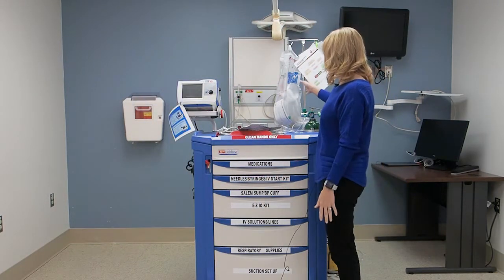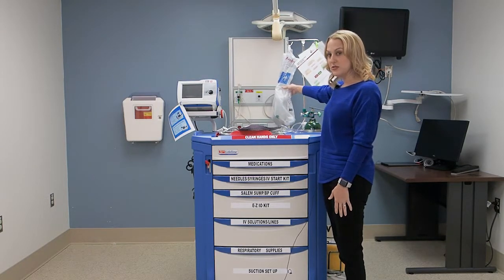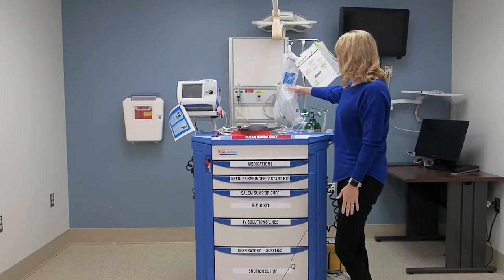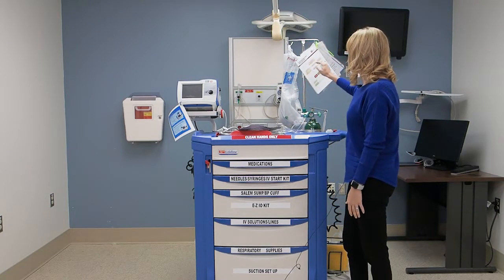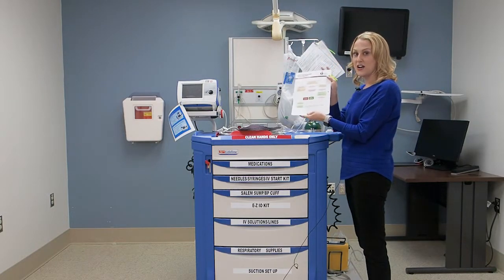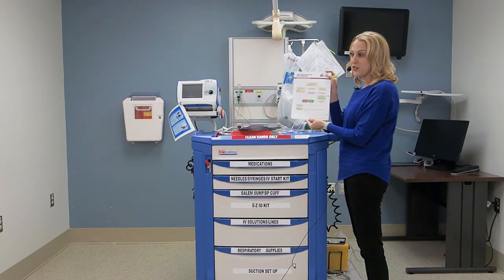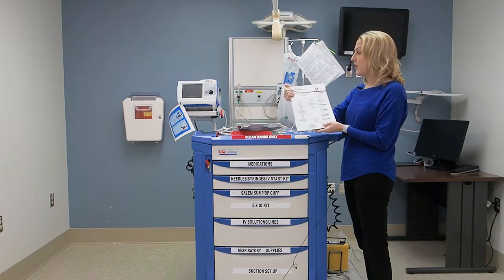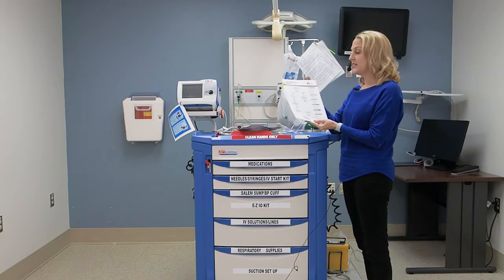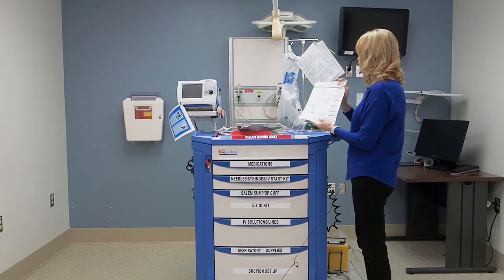And we're just going to work our way down. So we'll go right here, and on these poles, you're going to see the ambu bag that can be used during the code event. And so that's available for use. And then the next thing I want to discuss is the ACLS algorithms. Please make sure that you know that these are available, and whoever is running the code, you can take them down and give them to them for use during the code.